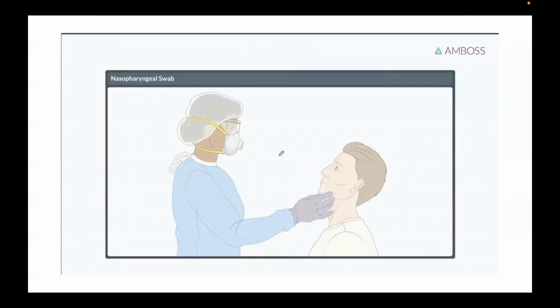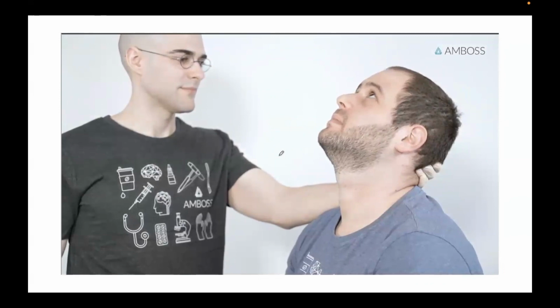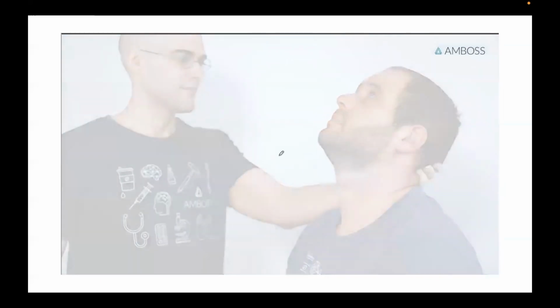The patient should be alert and cooperative. Allow them to first blow their nose. The patient should sit in a relaxed and comfortable position during the sample collection process. Tilt the patient's head back slightly and support it with your non-dominant hand. If necessary, lean the patient's head against a wall to minimize jerky movements. Stand slightly offset from the patient to avoid the risk of contamination in case of a sudden cough or sneeze. Be sure to advise the patient of potential discomfort during sample collection and let the patient know that they are welcome to close their eyes.